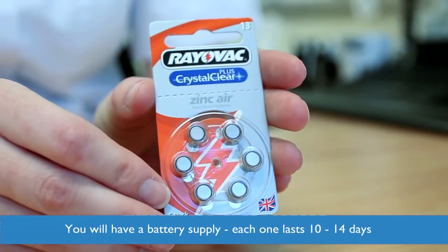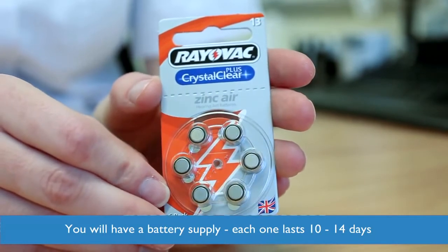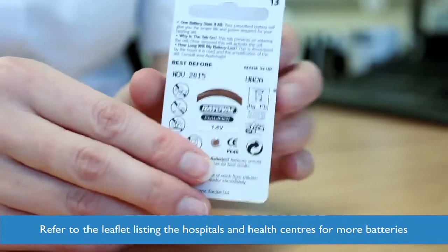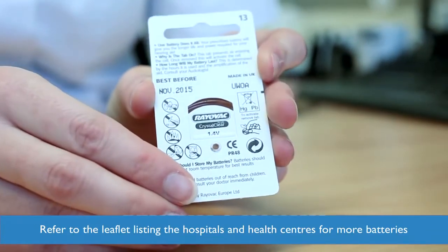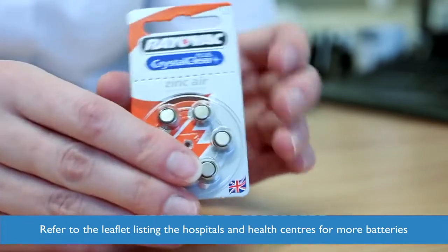You will have been given a supply of batteries, and each battery will last around 10 to 14 days when using the hearing aid most of your day. To collect more batteries, please refer to the list of hospitals and health centres you will have been given.